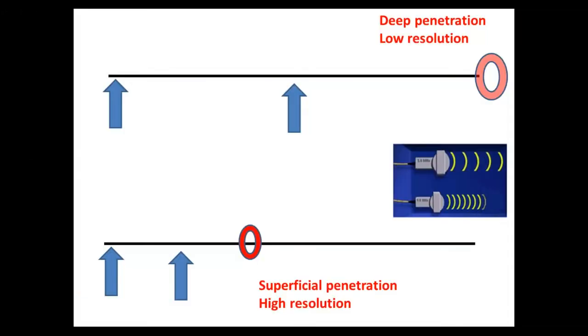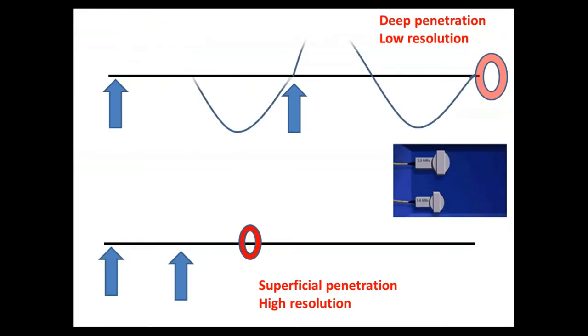General physics of ultrasound. Ultrasound is basically conversion of electricity, high rate interrupted electrical current, to ultrasound, in very high interrupted current rate, typically between 1 million interrupted current or ultrasound waves up to 20 million.